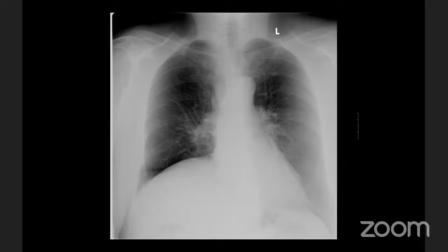So, first of all, I will look at the lung fields. To start from the beginning, the left side is here, the right side is here, PA projection. The right lung field is mostly clear. The left one, not so good. The costophrenic angle on the left side doesn't look so good. Not clear. However, the right one is good. They are not exactly symmetrical, the right and left side. The hilum is concave and looking good. The chest size is, I would say, mostly normal.